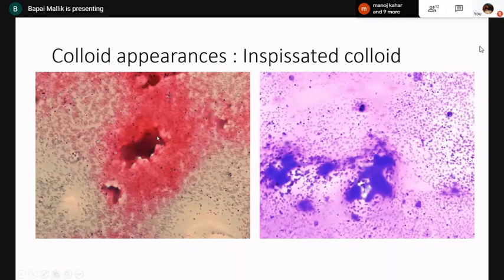This is inspissated colloid, thick colloid. Inspissated colloid is very important from the angle that when you don't see any other colloid and you see a papillary carcinoma, you can have this thick little chewing gum colloid, thick bits of colloid, inspissated colloid. But this, of course, is the case of colloid goiter most of the time. Once again, you see inspissated colloid in plain, simple, run-of-the-mill colloid goiter. Inspissated colloid means absolutely nothing unless there are other features of papillary thyroid carcinoma or other malignancies.